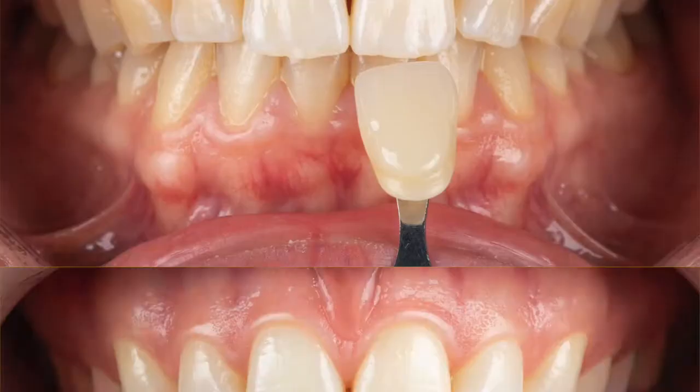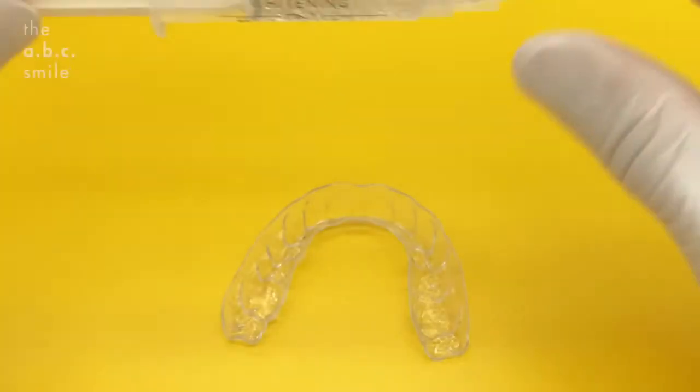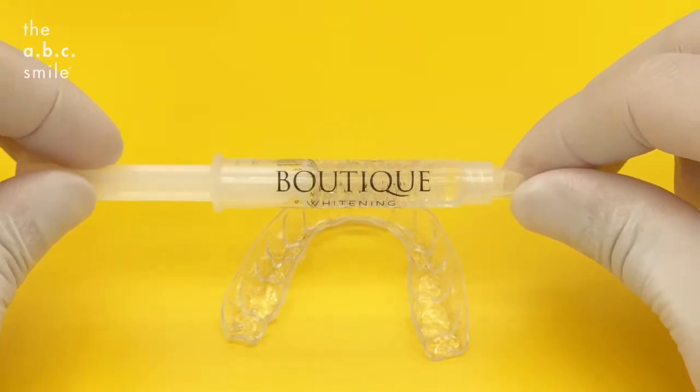How to load your whitening trays. This is your prescribed whitening gel. We have tailored the strength and prescription based on what your teeth need. Please keep these gels in the fridge at all times.